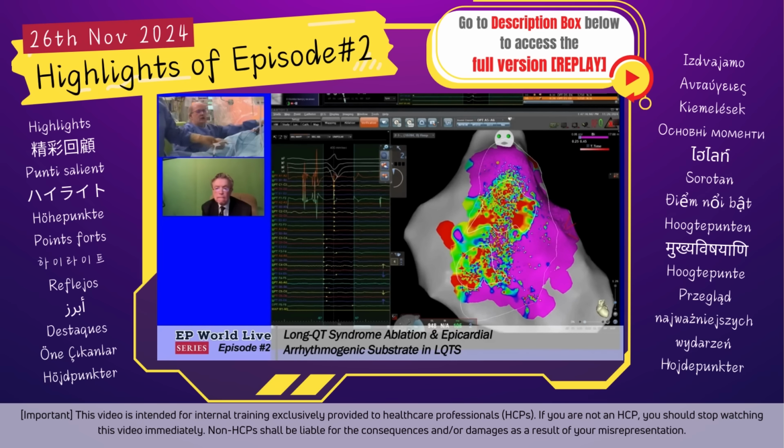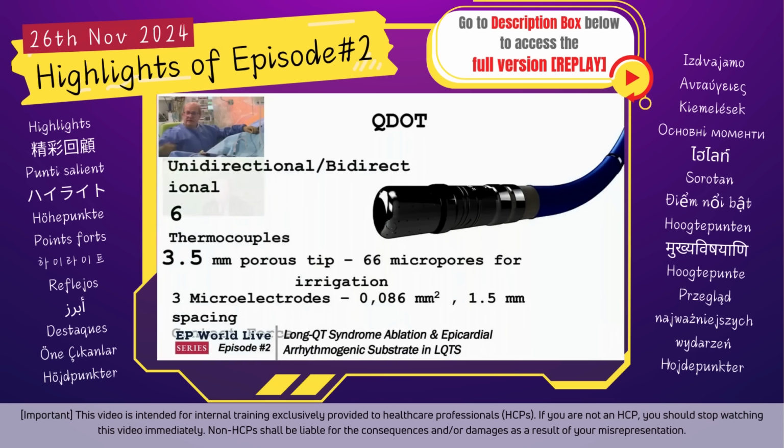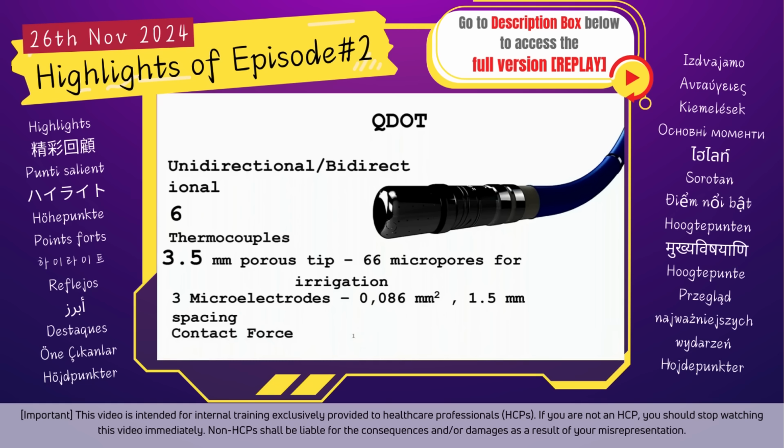Can we see the Q-Dot catheter? There we go. This catheter is extremely interesting. Describe it. Yeah. And so you see it's a 3.5 millimeter tip, with 66 micropores for the irrigation. The most important aspect is the presence of microelectrodes.